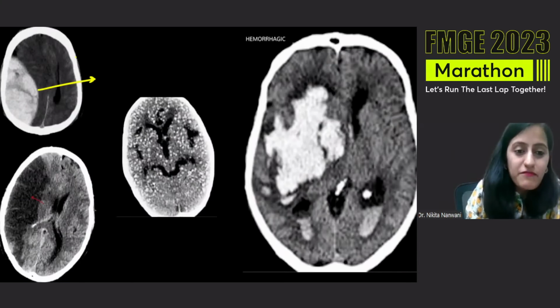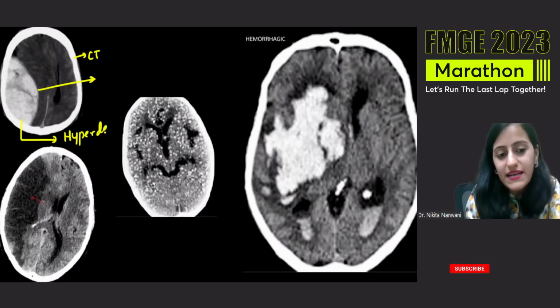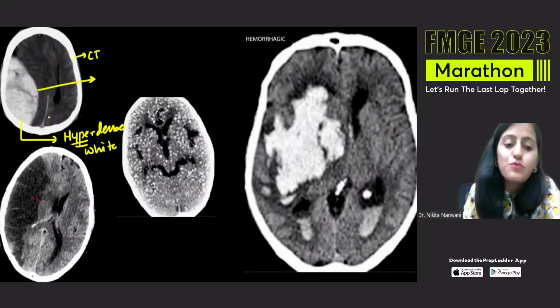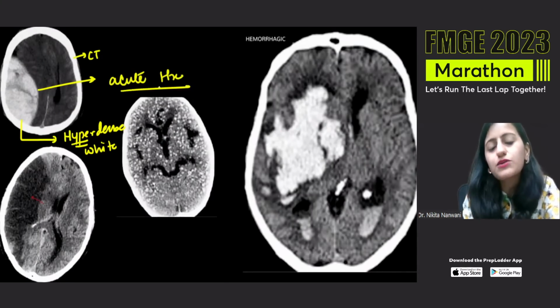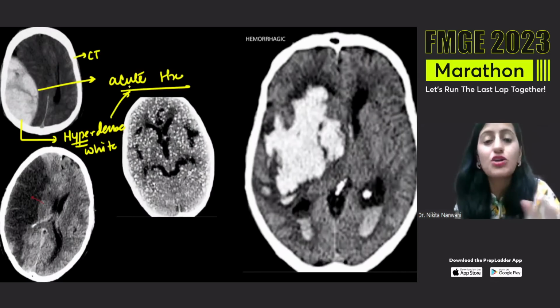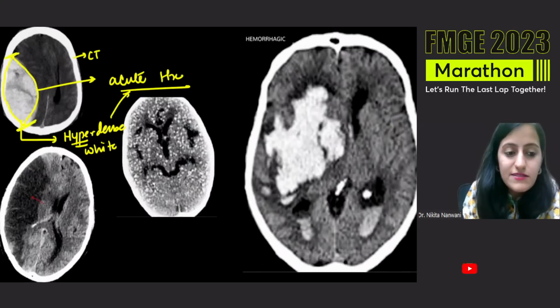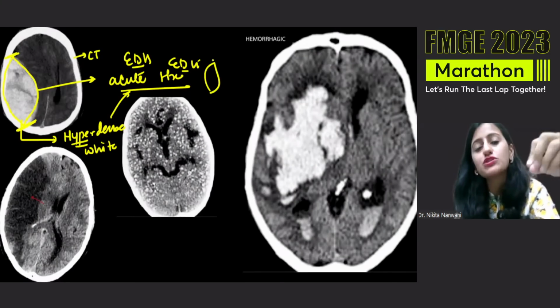So this one, first of all, it's a CT. This pathology here, this is hyperdense. Always remember in radiology that hyper means white and hypo means dark. This is white, so that means this is acute hemorrhage. Acute hemorrhage is hyperdense on CT, not chronic hemorrhage, right? And this one is the biconvex shape, limited by the sutures. That is EDH, which is lens shaped like this. That's EDH. It's rupture of MMA.